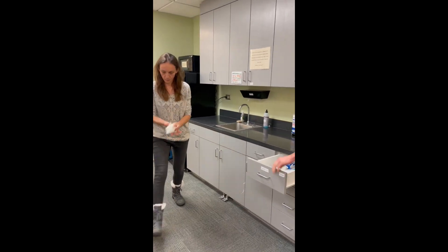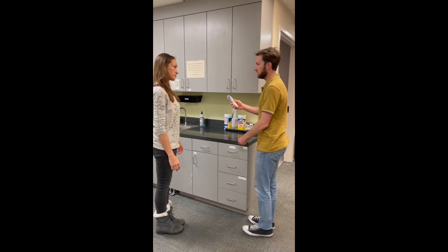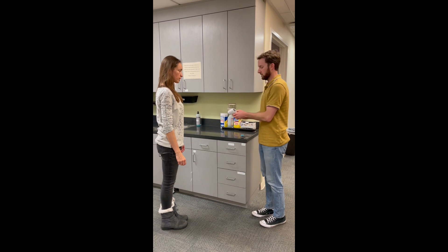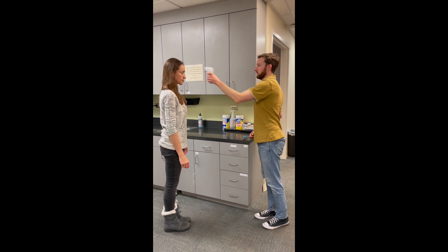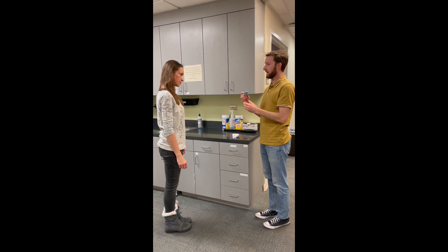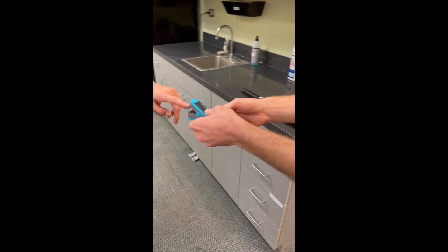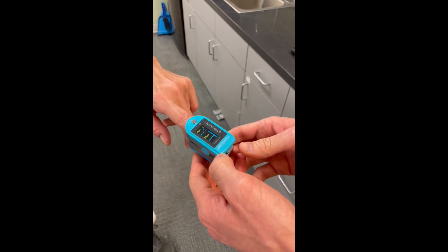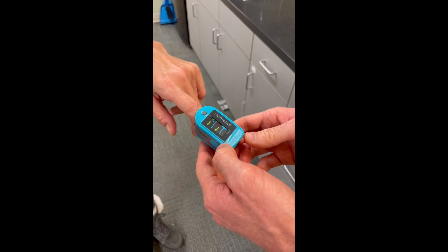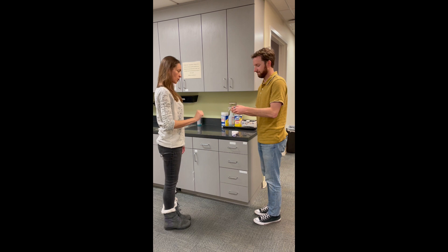Once your hands are dry, we're going to move on to taking a couple of physio measurements — an IR thermometer and a pulse ox device. I'm going to press and hold to take your temperature. As long as it's within the standard range, we're good to continue. For the pulse oximeter, I'm going to go ahead and clip this over your finger.